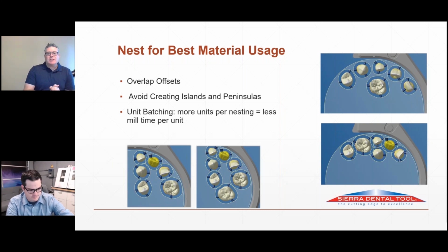and your day starts, I have seen multiple people, in order to get the mill running, nest 20 units in one puck. They're sitting there turning the connectors and rotating it to get the most of it. 30-minute process. They spend 30, 40 minutes trying to do that, and then they hit calculate and walk away. And there's another 30, 40 minutes. The mill still hasn't even started its day yet. It's sitting there doing nothing.